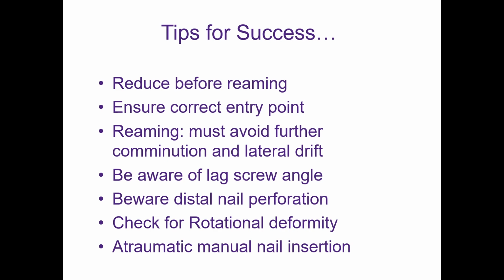So, some tips for success when using an IM nail, which is the most common implant used in 2025. You really want to make sure you've reduced the fracture before reaming. You want to ensure that you have a correct entry point. When reaming, you want to avoid further comminution and lateral drift. You want to be aware of the lag screw angle and distal nail perforation. You want to check for rotational deformity. And you want to ensure that there's atraumatic manual nail insertion.